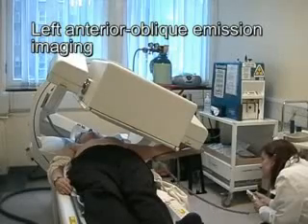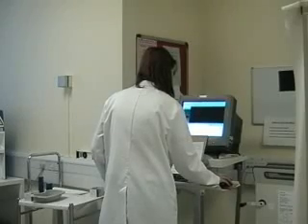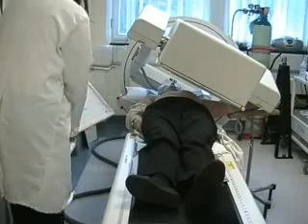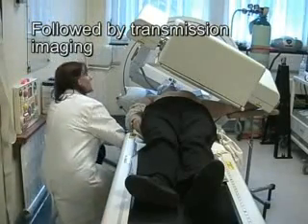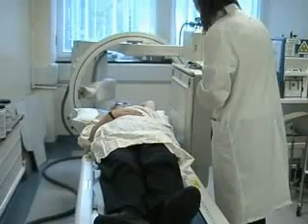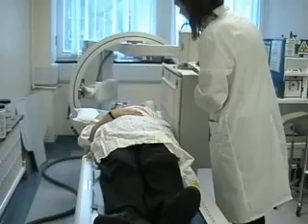For imaging, the patient is positioned supine in the operating position with the camera angled at about 30 degrees. First, the emission image is acquired followed by a transmission image using a cobalt flood source, which will add some anatomical information to the image. The emission and transmission imaging is then repeated in a lateral position with the patient's arm abducted.